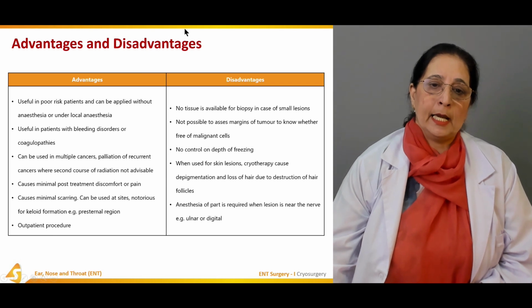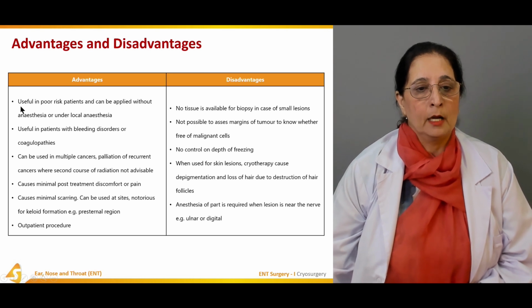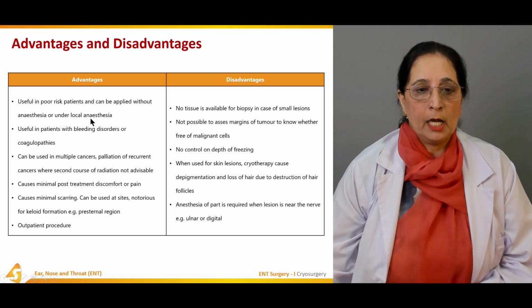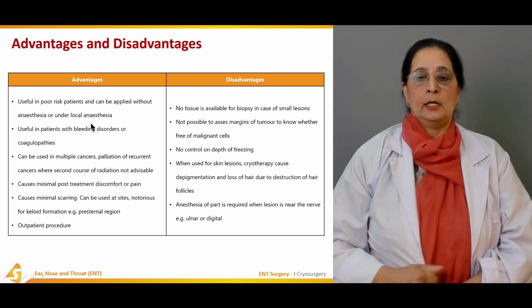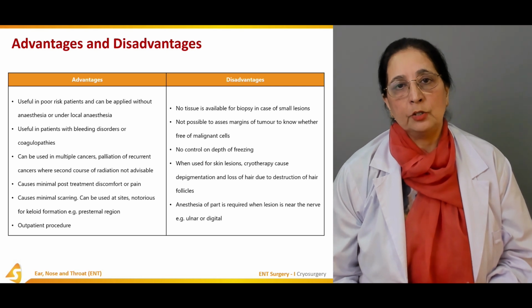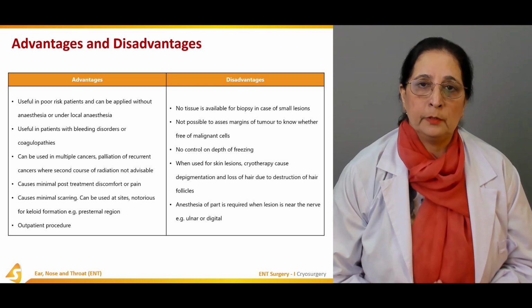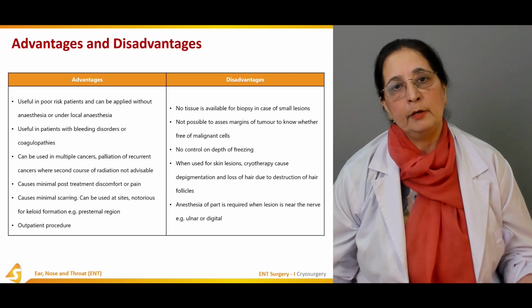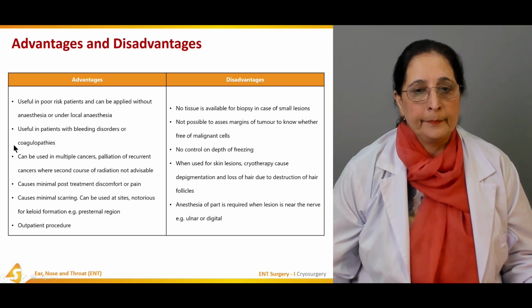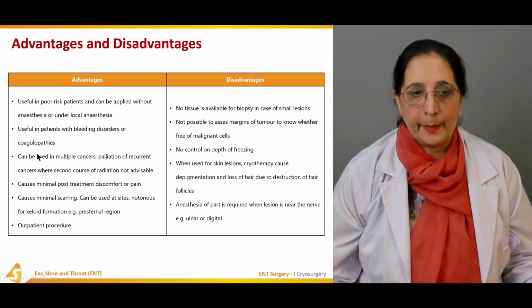Now, the advantages and disadvantages of the use of cryosurgery. Some advantages: it is useful in poor risk patients and can be applied without anesthesia or under local anesthesia. In a lot of cases, general anesthesia is not safe to use in those poor risk patients, so we can perform it under local anesthesia. It's also useful in patients with bleeding disorders or coagulopathy.